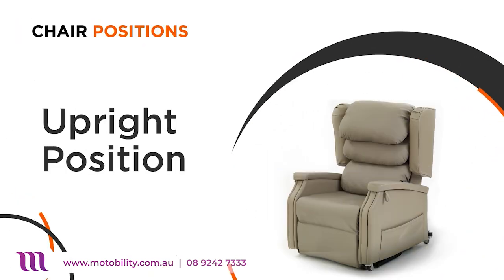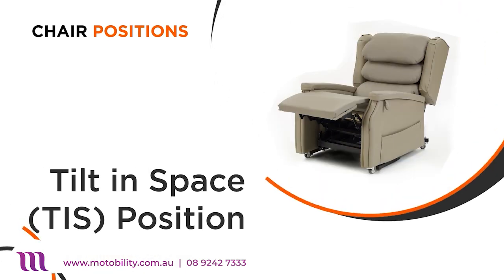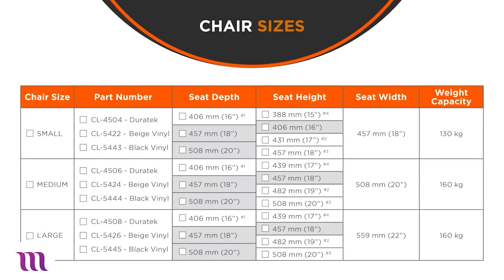The Configura Comfort chair can be placed into multiple positions, including seated and recline positions, and a raised chair position to assist you when standing. The Configura Comfort comes in three sizes: small, medium and large, so you're sure to find the perfect fit for your needs.